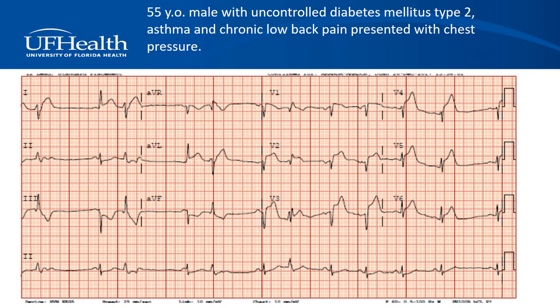This patient had an initial EKG and troponins that were unremarkable. The patient was then admitted for an evaluation of chest pain.